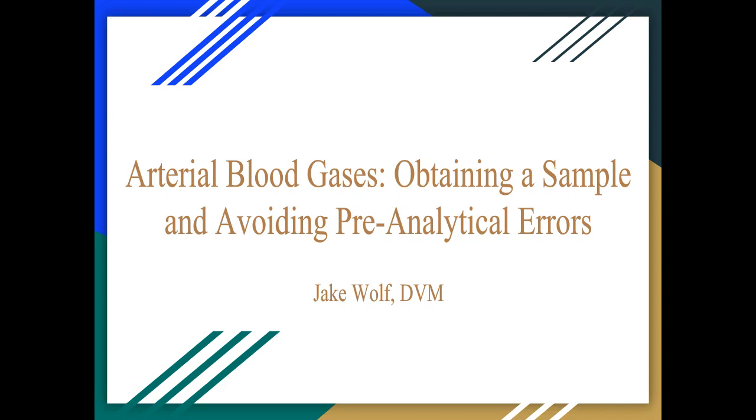Importantly, studies in human medicine have shown that pre-analytical errors account for approximately 75% of the errors in blood gas analysis. Therefore, it's very important to think about the possible causes of these pre-analytical errors when obtaining a sample.